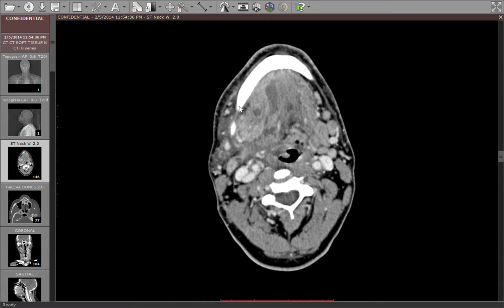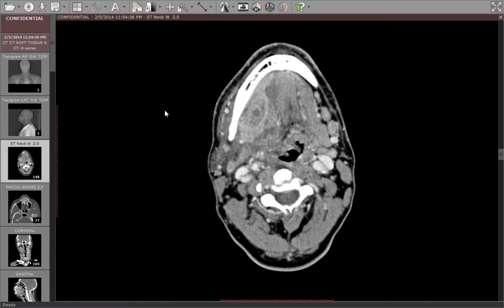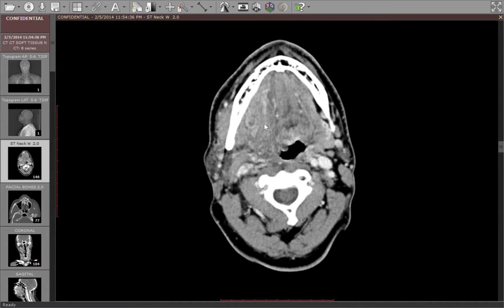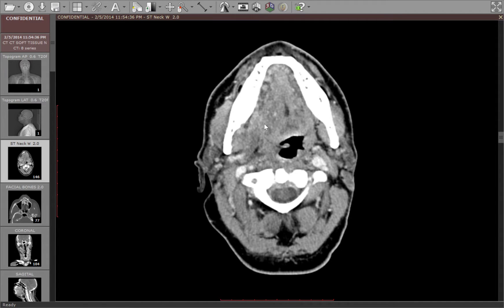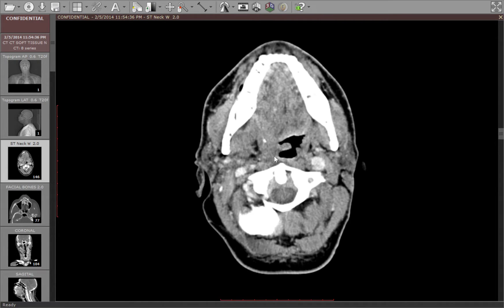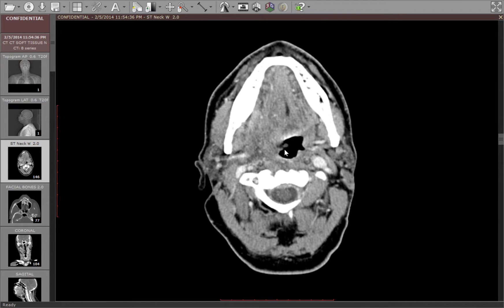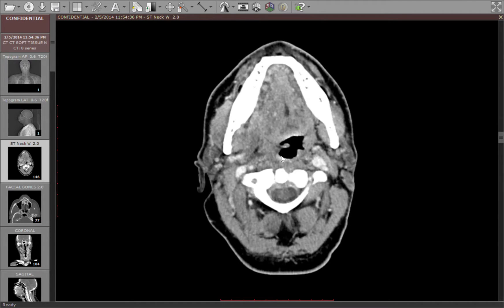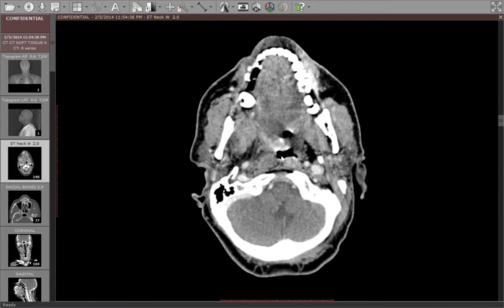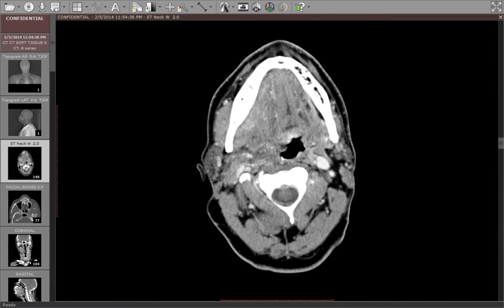As I continue superiorly, you can see there are fluid collections that are partially rim-enhancing in the floor of the mouth. There's a lot of edema in the floor of the mouth and the lateral pharyngeal, parapharyngeal space with mass effect on the airway and effacement of the mucosa on that side.